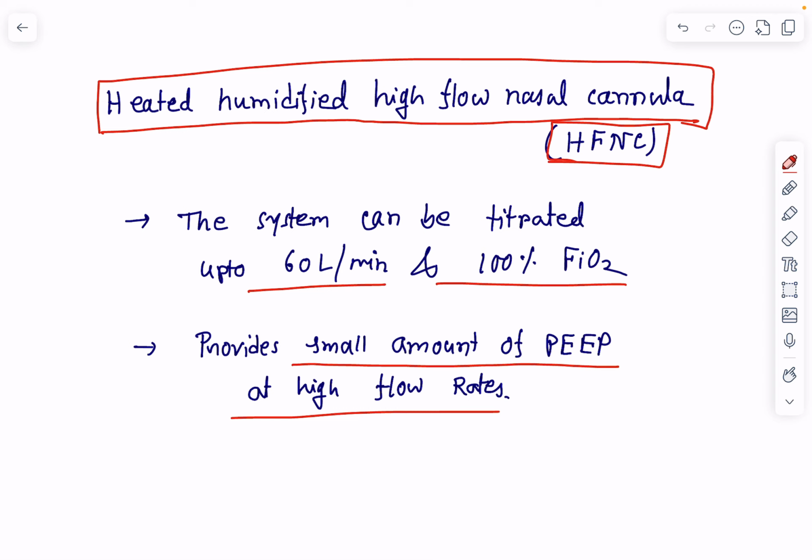It has been seen in various studies that when high flow nasal cannula is used, it can improve morbidity and even sometimes the mortality rate can also be reduced in patients.